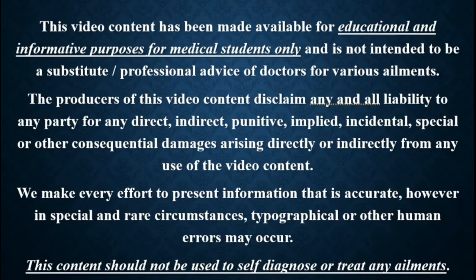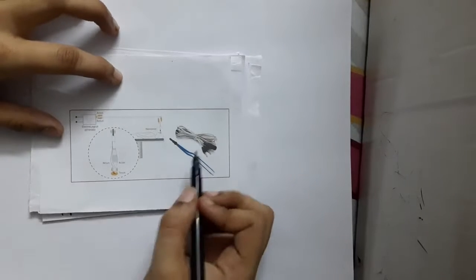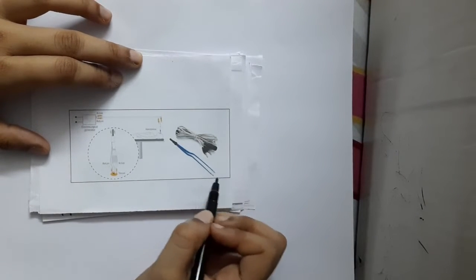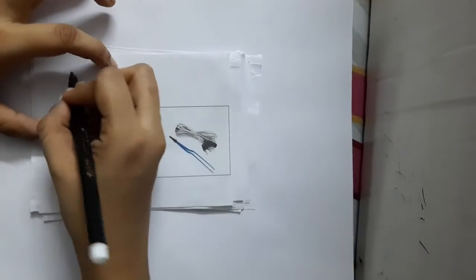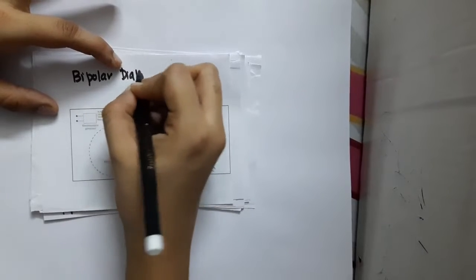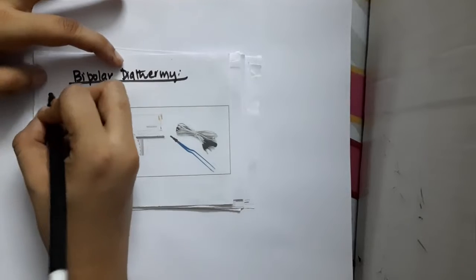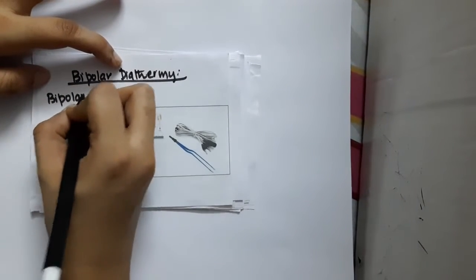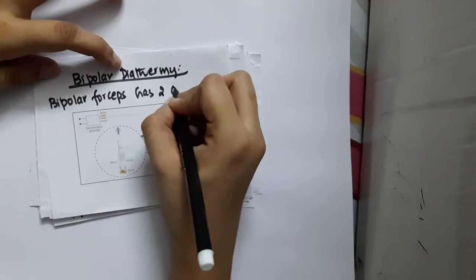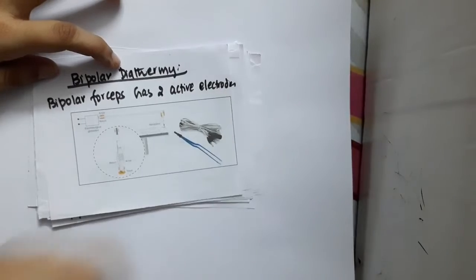In this lecture, we will learn about... Hello friends, what is this instrument? If you see, there are two poles here. There are two poles. So what is this? So this is bipolar diathermy. In this bipolar diathermy, there is a bipolar forceps and it has two active electrodes.